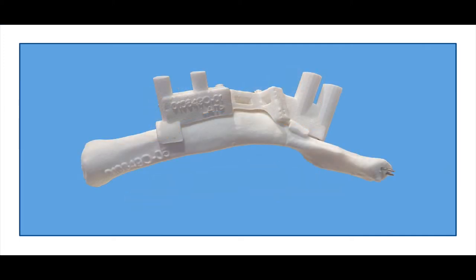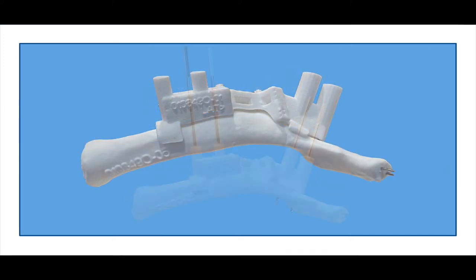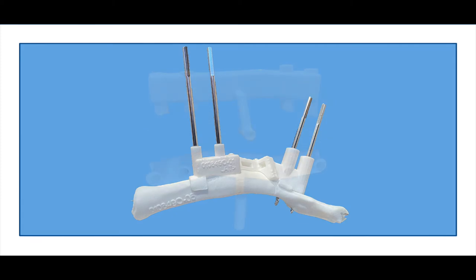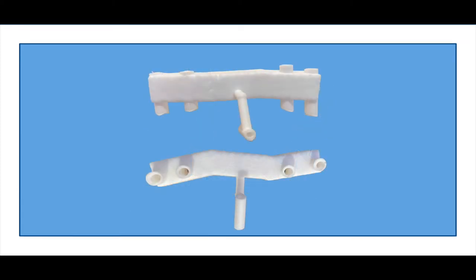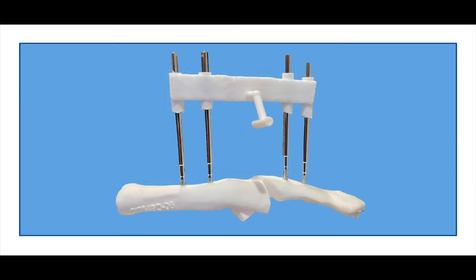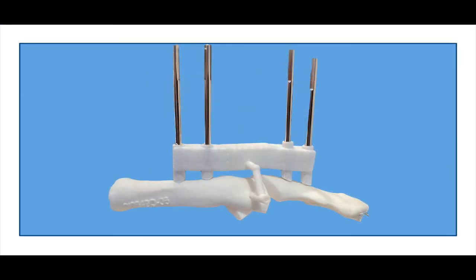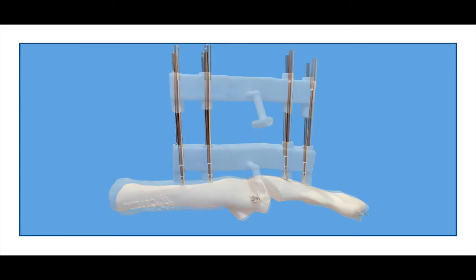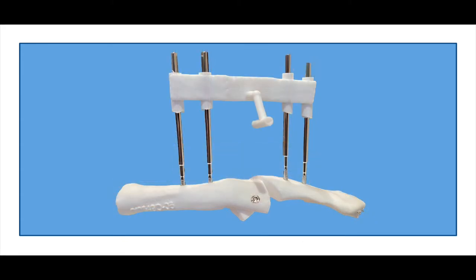The jig is positioned on the clavicle and held in position with Steinmann pins. The osteotomy is then performed. Using the reduction jig, the Steinmann pins from either side of the osteotomy are aligned, the drill hole for the lag screw is made, and the lag screw inserted. The plate is then contoured and fixed in position.